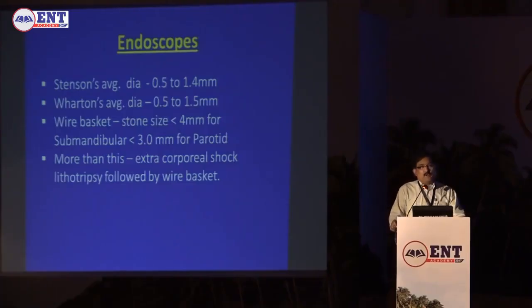Now, any of you who want to learn about salivary endoscopy, you must become friendly to a urologist, because all the techniques of salivary endoscopy which I am using, I basically learned from urologists, because they are the people who have been using baskets, dilators, guide wire, through the guide wire introduce a stent. These are all very common for them. So you talk to them more often, you learn these techniques from them, and you can proceed.